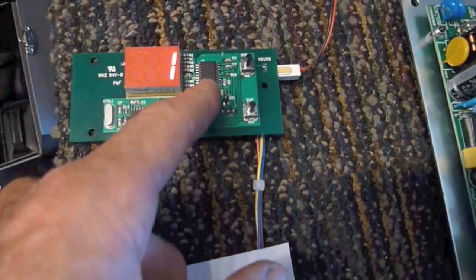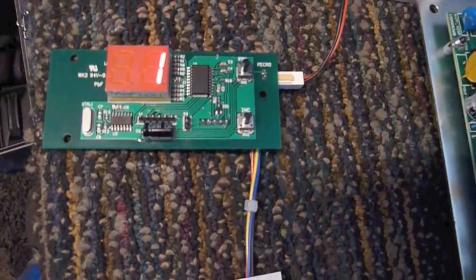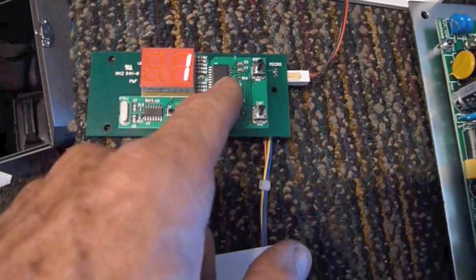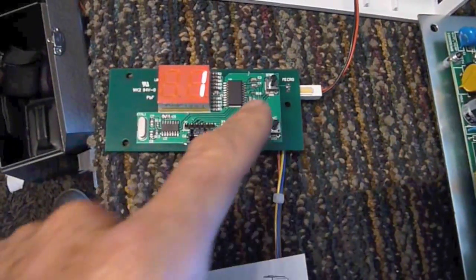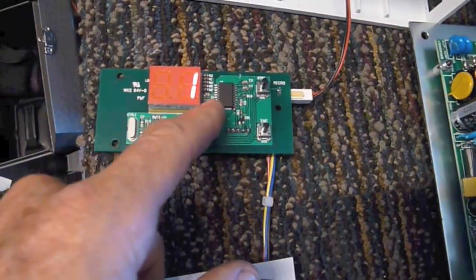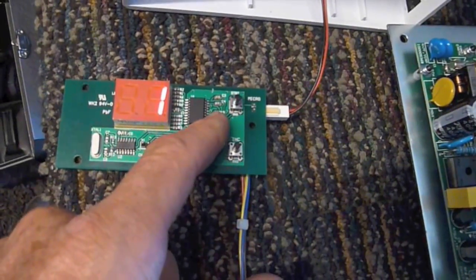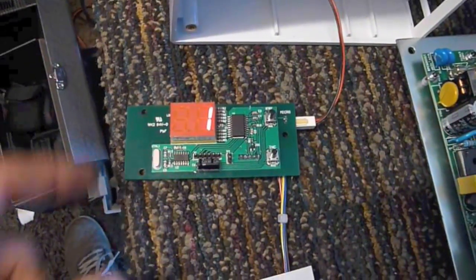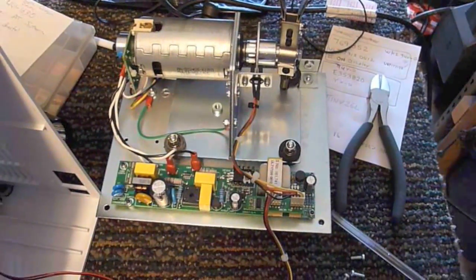I took my air hose, I took tuner cleaner, I took rubbing alcohol, and I just kept cleaning and cleaning, and then I superheated everything here. I resoldered a few connections too, but I believe it might have been the cleaning part that got this thing working, because when you're talking about such a low voltage, a little mineral deposit from the water between the two contacts here can really foul up the works. So anyway, it's a $700 unit, so they're obviously going to be happy with me when I tell them it's working.